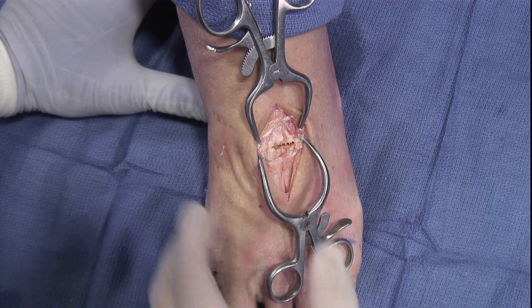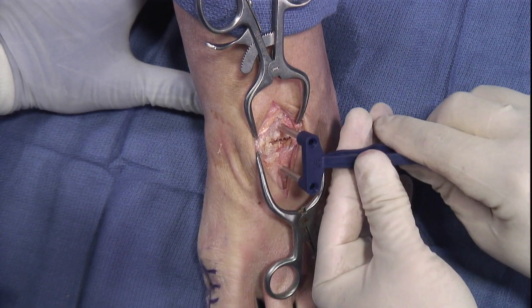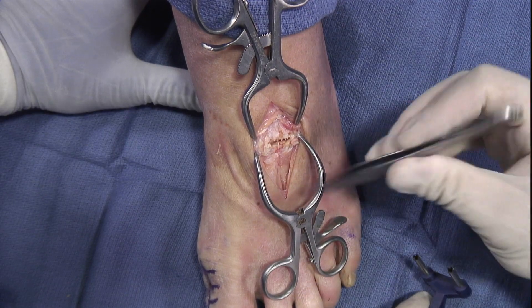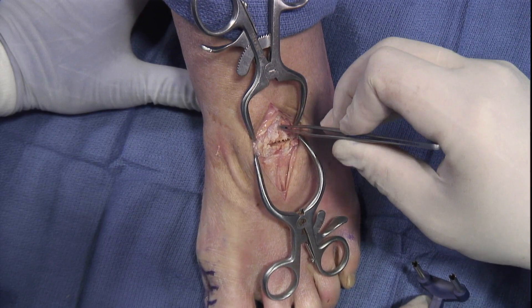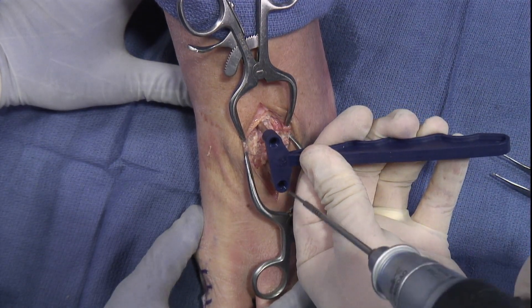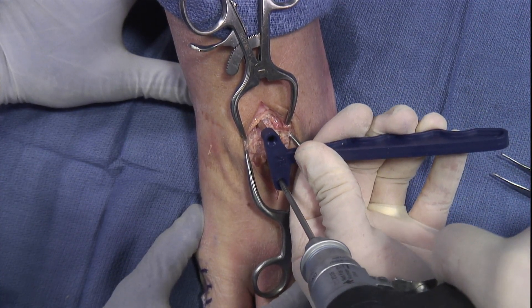We've prepared the joints. You can use temporary fixation if you need to, but we'd also like to see how much the staple compresses together. We want to be centered on both of these bones here — both the second metatarsal as well as the middle cuneiform. Here's the edge and our lateral border. It looks like we're pretty equidistant on both sides, bicortical here if need be, and I'll just make a drill hole here in the second metatarsal.